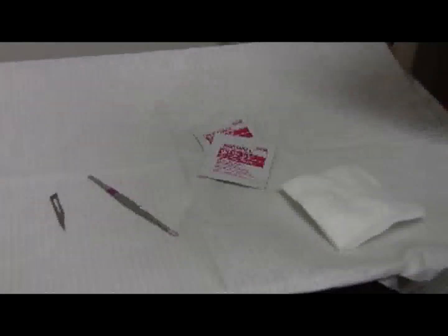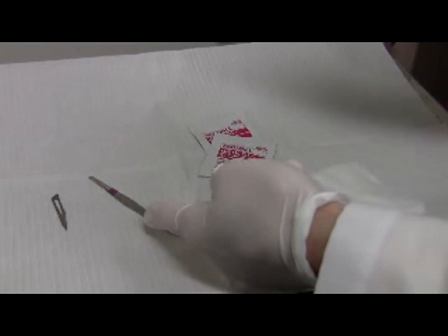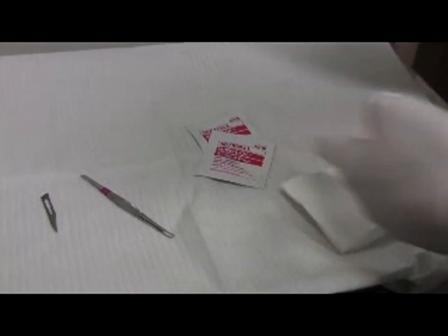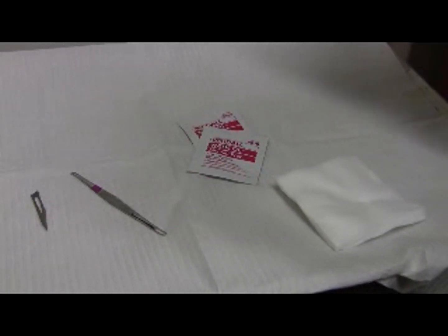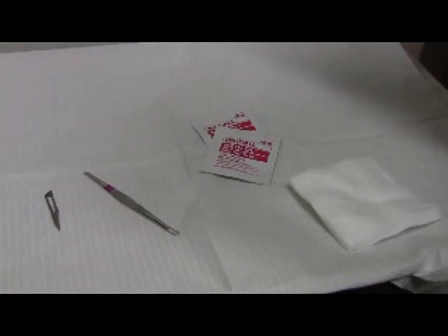Today we're going to do acne surgery. The materials are an 11 blade, a comedone expressor, and alcohol and gauze. You can also use a 25 gauge needle instead of the 11 blade, but I prefer to use the 11 blade.